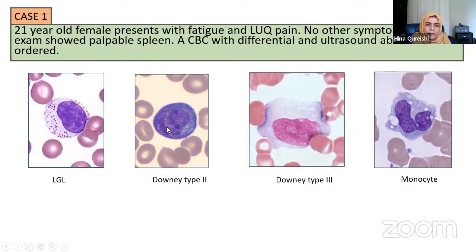This patient also had some cells that look like this. They have a very dark blue cytoplasm. They have some small nucleoli, but still have abundant eccentric cytoplasm, very different than LGL. So keeping this cell in mind, we look at what else is there. There's another cell that has a lot of cytoplasm, and it's kind of scalloping around these red cells, and it does have a big nucleolus. These cells are subtypes of reactive lymphocytes.